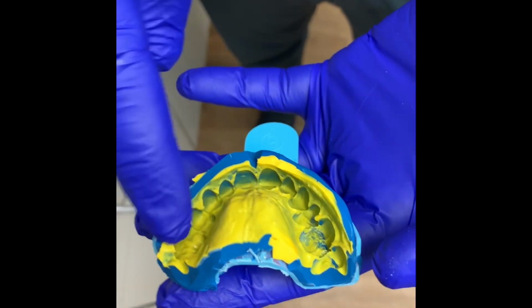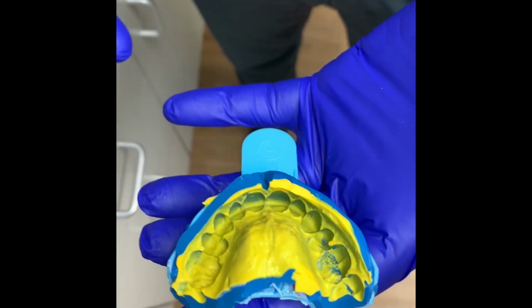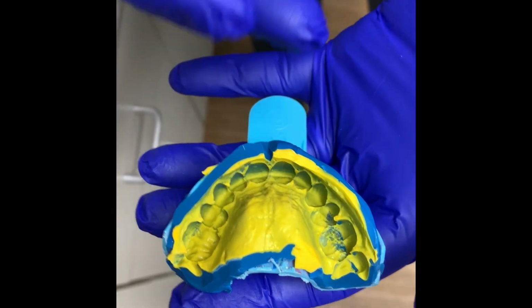When that patient comes in, you'll fill this in with Luxatemp and be able to fabricate a really nice, form-fitting temporary with minimal adjustments. So I hope that you found today's tip helpful and informative, and I hope that it benefits you long-term for your provisionalization of your aesthetic and long-term provisional cases.